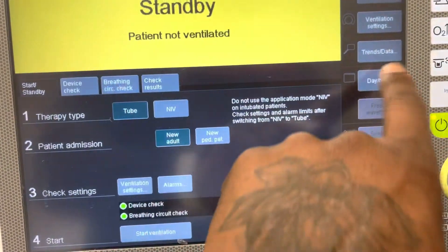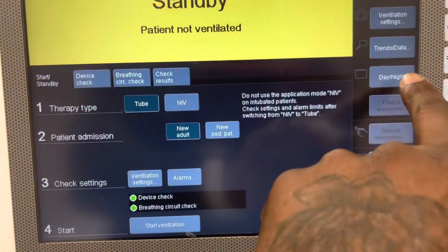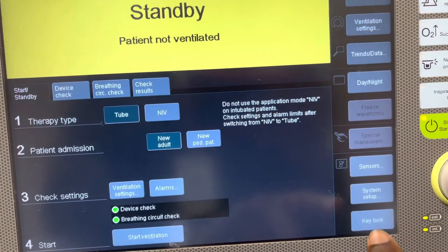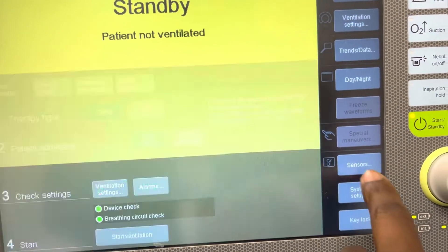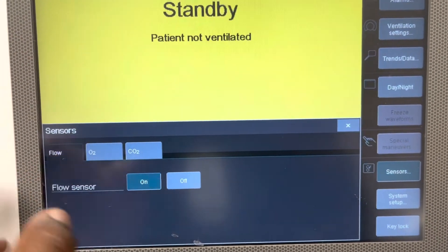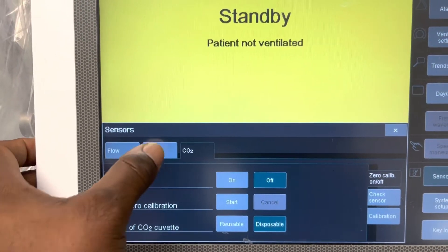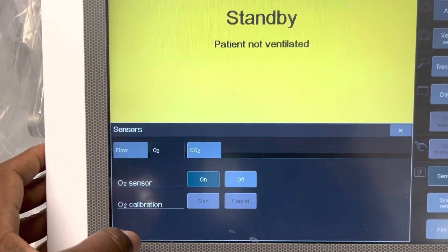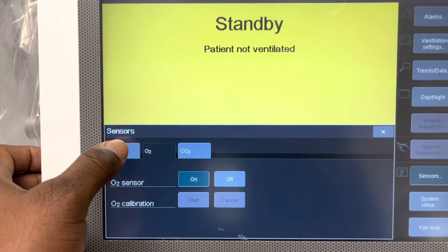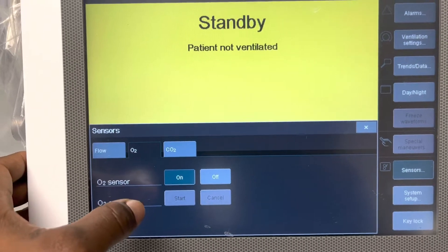We can adjust the nighttime or daytime settings on this particular ventilator. It also has sensors — an O2 sensor and a tidal CO2 sensor — which we can both analyze and calibrate on this machine.